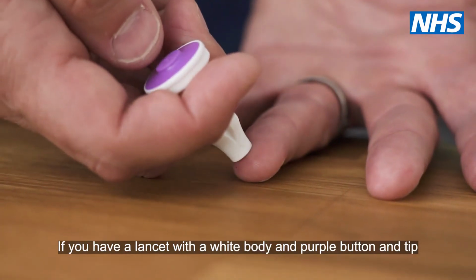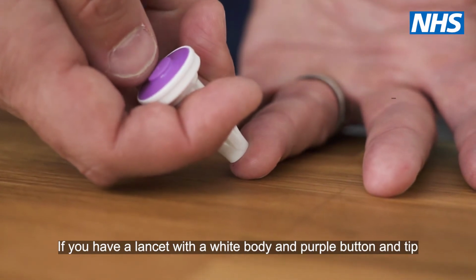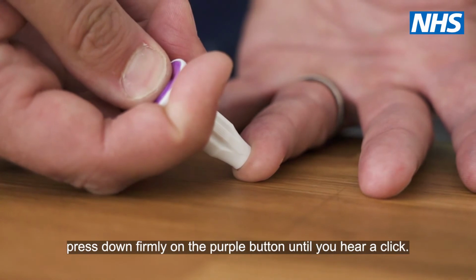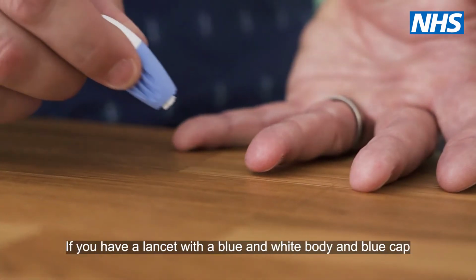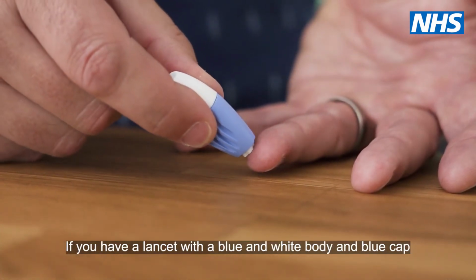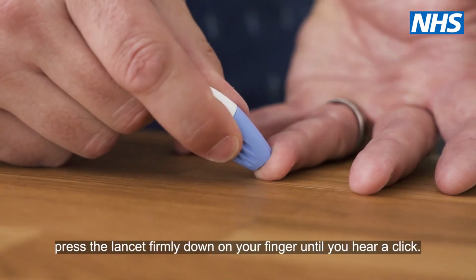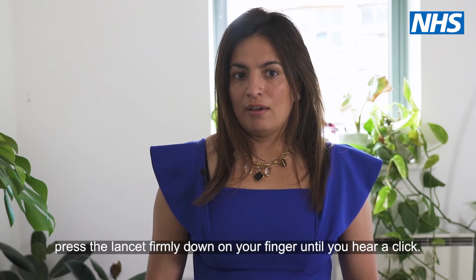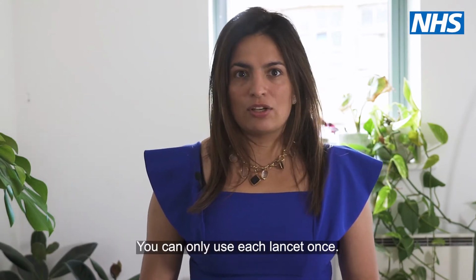This part is less sensitive and it's easier to direct your blood. If you have a lancet with a white body and purple button and tip, press down firmly on the purple button until you hear a click. If you have a lancet with a blue and white body and blue cap, press the lancet firmly down on your finger until you hear a click. You can only use each lancet once.